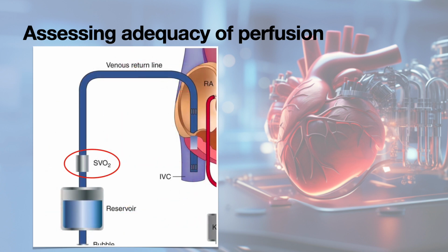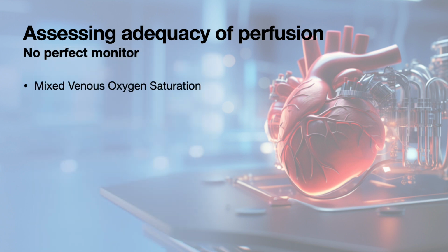Just like in any other patient, the mixed venous O2 will almost certainly tell you something about the adequacy of global oxygen delivery, but will certainly miss some small, inadequately perfused vascular beds which contribute only a little to the total venous return. While a low mixed venous O2 must certainly be dealt with, a normal or high mixed venous O2 is not necessarily a reason to let your guard down. An evolving metabolic acidemia could be a sign that something is not being adequately perfused. Without organ-specific perfusion data, it will be impossible to know specifically what is being underperfused.